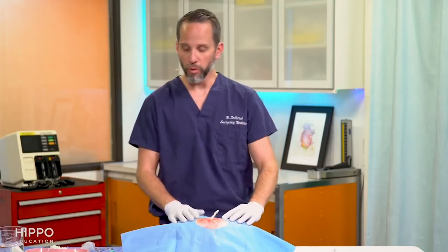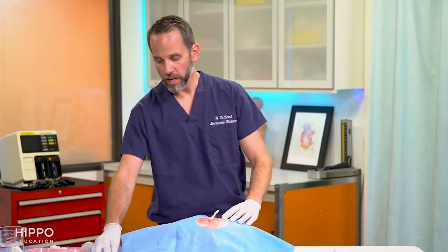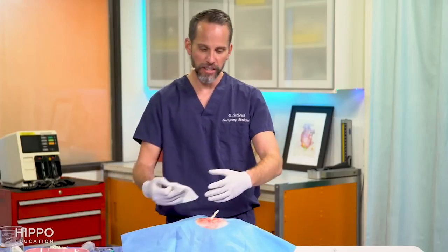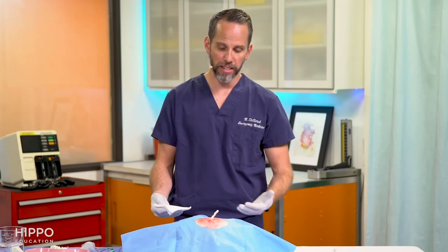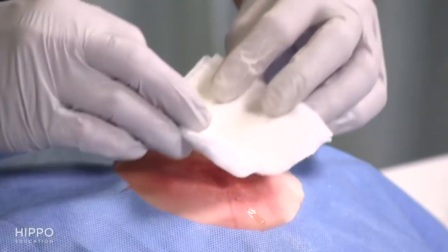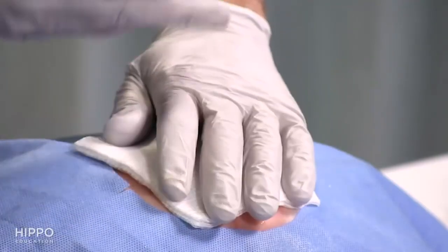The final step is applying an absorbent gauze dressing. The wound will continue to drain over the next couple of days with the packing in place, so use a bandage that will effectively pull up that drainage.